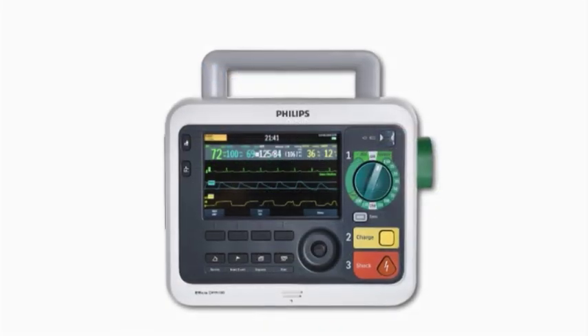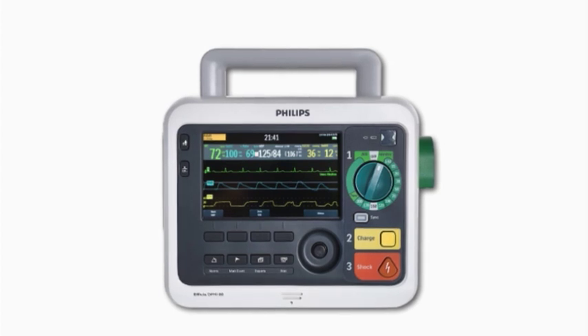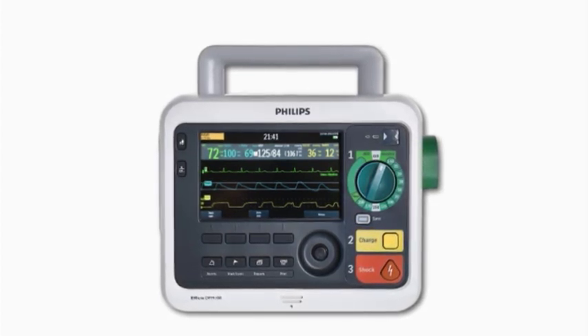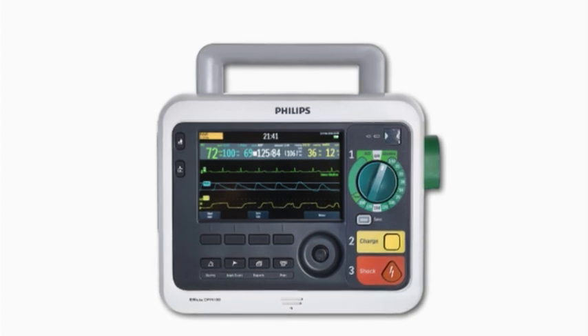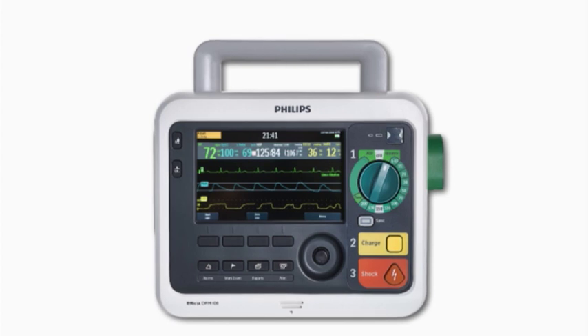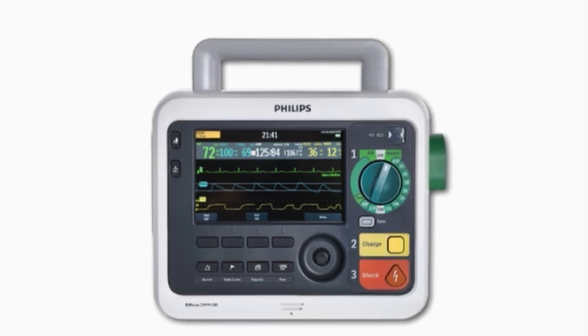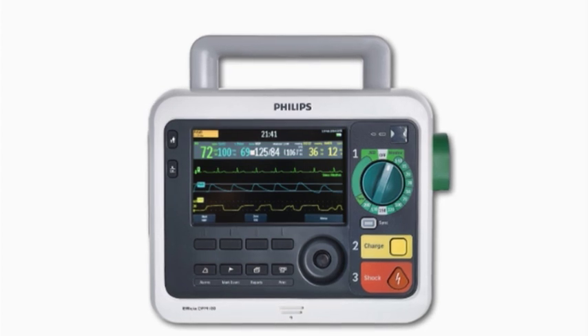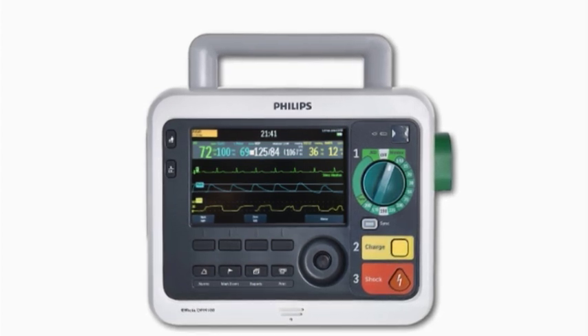The Officia DFM100 Defibrillator Monitor is a lightweight, portable, and versatile device designed so you can meet the demands of adult and infant-child patient care in the pre-hospital and hospital environment effectively and consistently. It combines a comprehensive set of features in a device that offers easy-to-use, intuitive operation.